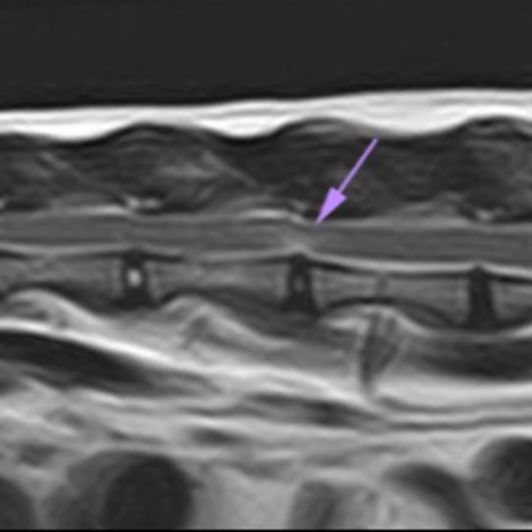Waiting for more questions. I can't remember. Did you have any intramedullary disc extrusion in your study? No, we didn't. No. Because obviously that's the question.